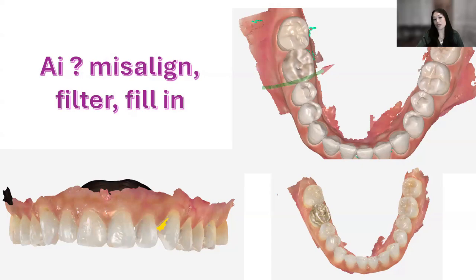Correct. But Kelly, what if this was for line of therapy on the top? I would want to go back in and rescan it to make sure that it was true, accurate data, not AI supported. Why? Because it's more accurate if it's really scanned. AI is good, it's filling in points of data, but I don't know. Yeah, you want that to fit nicely. Yeah. Mhm.